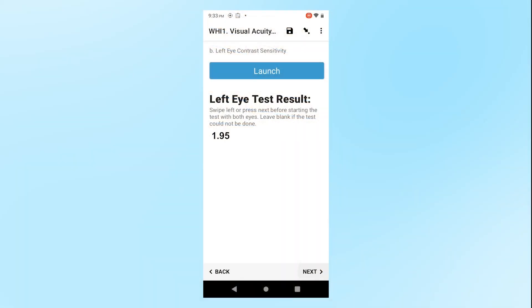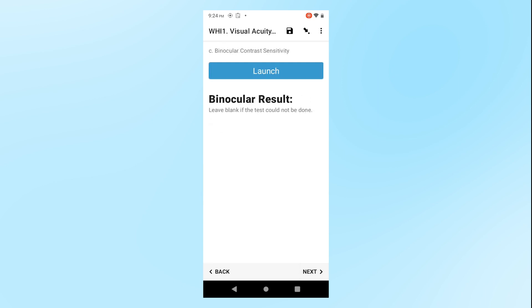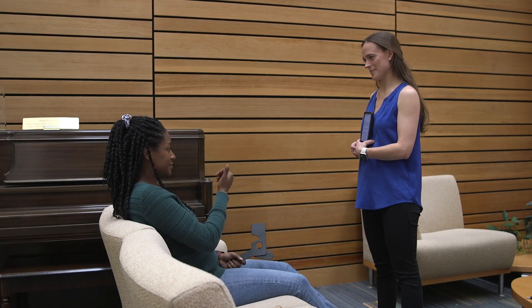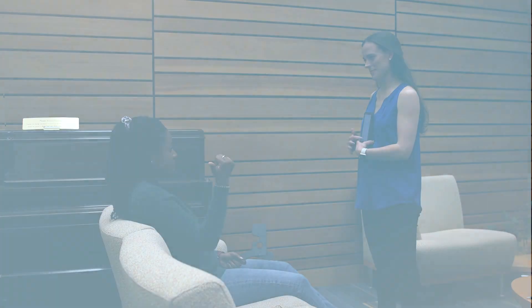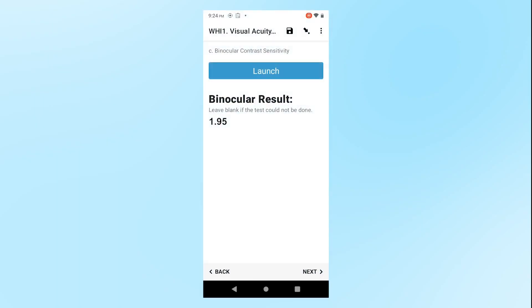After you have completed the screening with the left eye and confirmed that you see the left eye score on the ODK form, press Next again to conduct the screening with both eyes. The participant will not need the occluder for this screening. Confirm that the page says Binocular Contrast Sensitivity at the top and press Launch to begin the screening. After completing the screening with both eyes, confirm that you see the score on the ODK form and press Next.